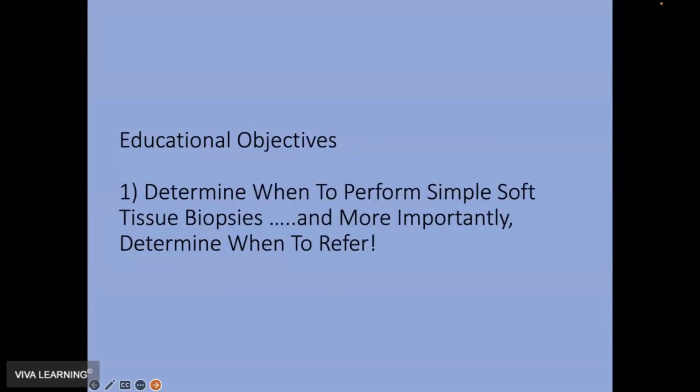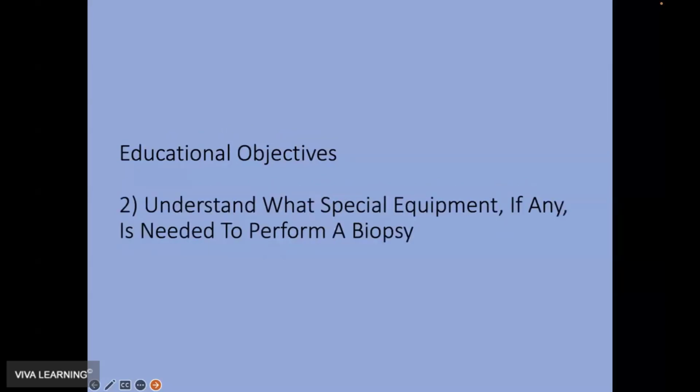There are a couple of educational objectives for this. Number one, determine when to perform simple soft tissue biopsies, and more importantly, determine when to refer. You may not want to biopsy everything you see if you think that there's a malignancy involved. Objective number two, understand what special equipment, if any, is needed to perform a biopsy. The short answer is no, and we'll get to a discussion of that.